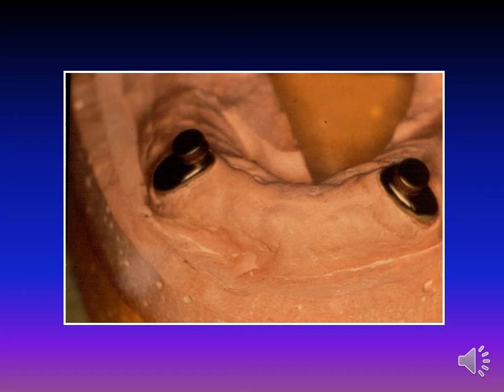There are many advantages of magnets, which include ease of cleaning, ease of placement for the dentist and patient, automatic reseating, decrease in horizontal stress transmission, and retention that is not reduced with use. Magnets have poor corrosion resistance when exposed to oral fluid and therefore require encapsulation with an inert alloy such as stainless steel or titanium.